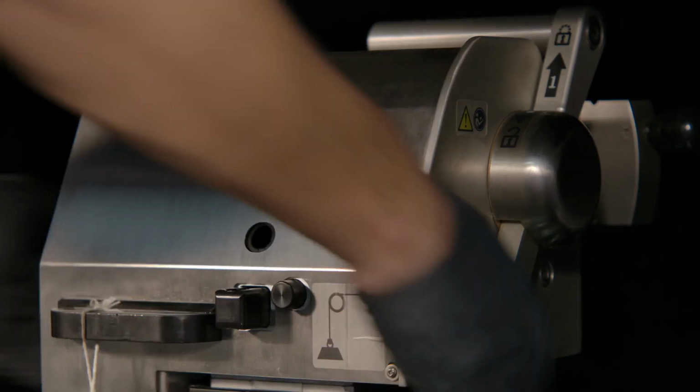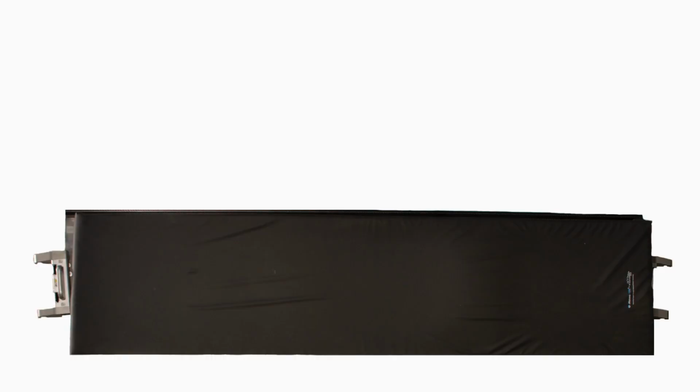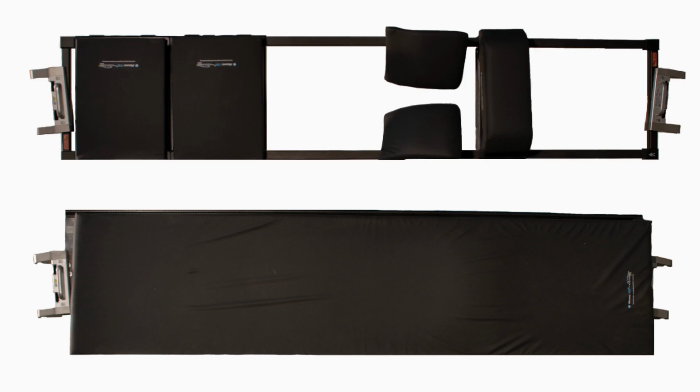Pull the Trios table base out of the crate and guide it down the ramp. Once down the ramp, place the table in an area that is large enough to extend the base. There are two different tabletops for the Trios: a radiolucent imaging top and a spinal surgery tabletop.